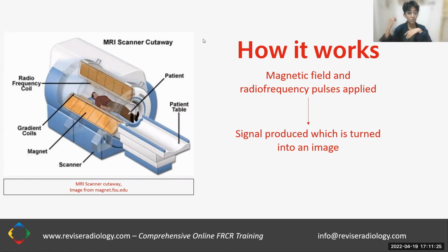We've seen it doesn't use ionizing radiation. So what this means is you can expose the patient without being worried about cancer risks and things like that. We've also seen that it's non-invasive in many cases, and it gives us high contrast in certain examinations. It's also a very diverse and versatile imaging modality, and we're able to look at a number of different clinical parameters to get the information we need about what's happening in the patient's body.